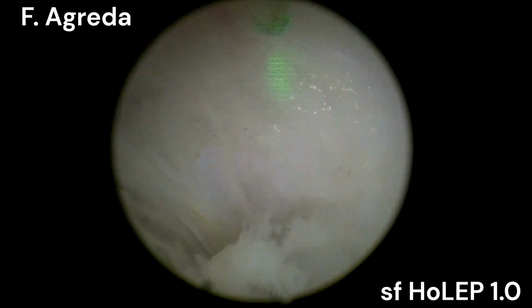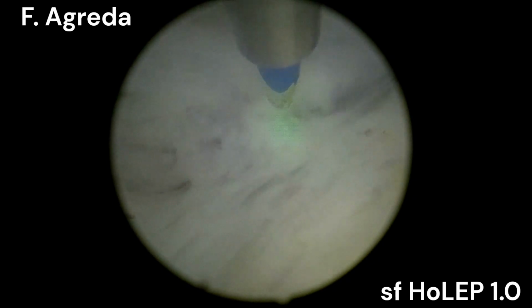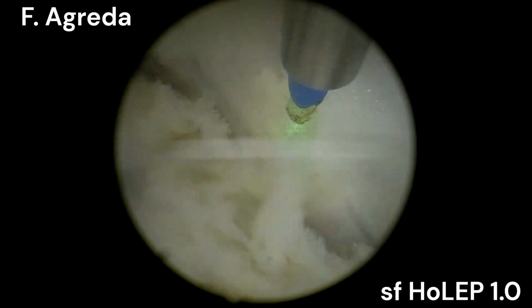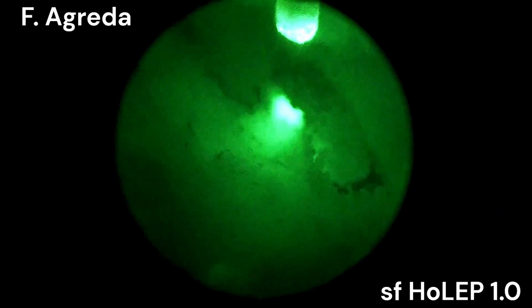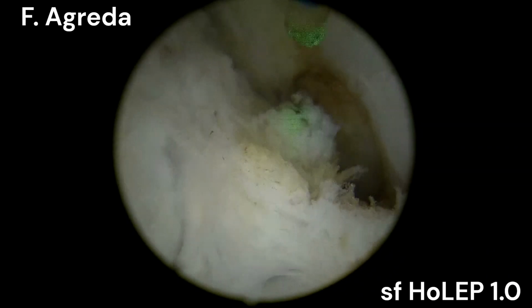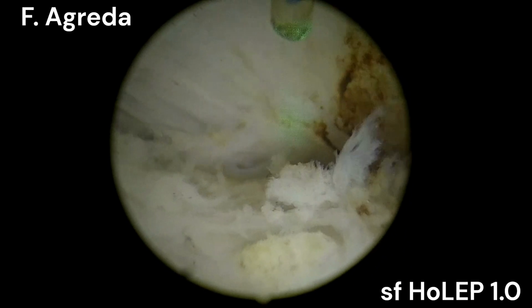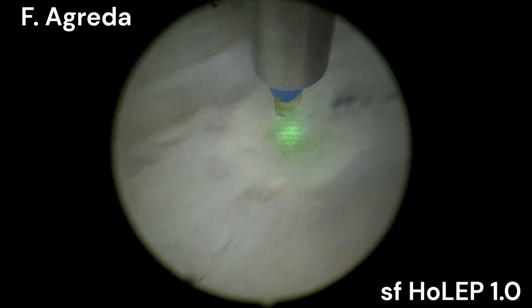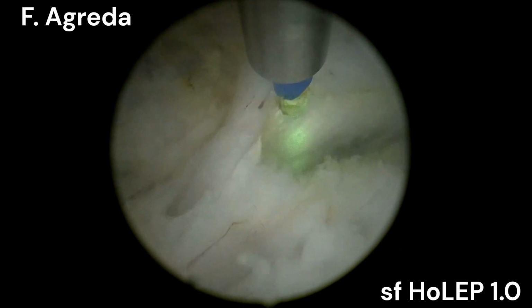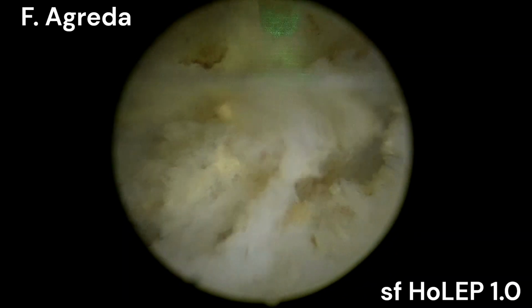So I'm going here in the anterior aspect. It's kind of a sticky prostate. It's not a very good plane. It's not very easy to progress, but oh, there's something here. Probably the light cable was off. We're back to life. So there's some more progression here till we get to the bladder capsule, vertical bladder fibers.